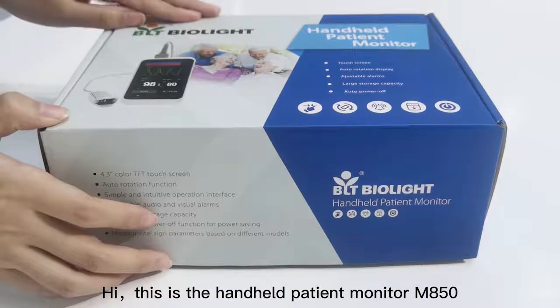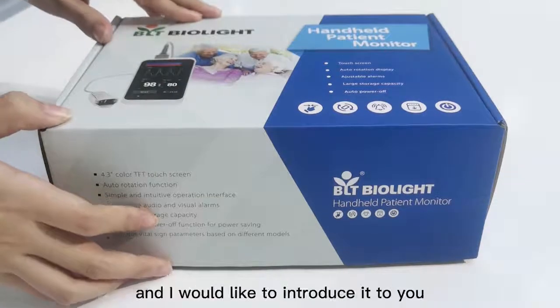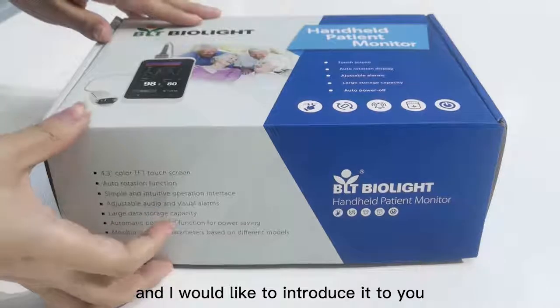Hi, this is the Handheld Patient Monitor M850 and I would like to introduce it to you.